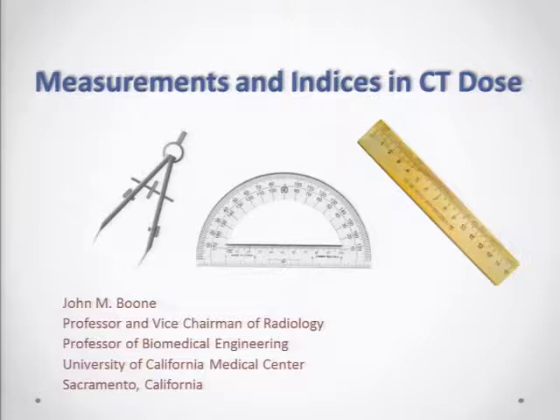Right, I understand. What I was asking is whether that fitting would work even within the length of a normal 15 centimeter, smaller phantom? Probably not, because you're not getting the backscatter. The scatter at the center of a large phantom has been scattered 5, 6, 8 times with decreasing prevalence over that range.